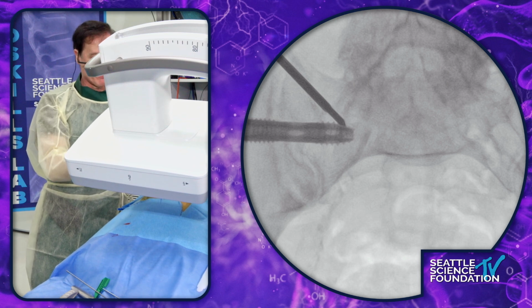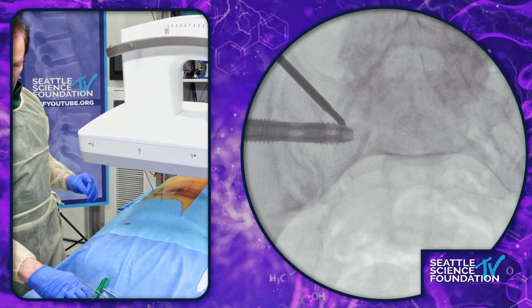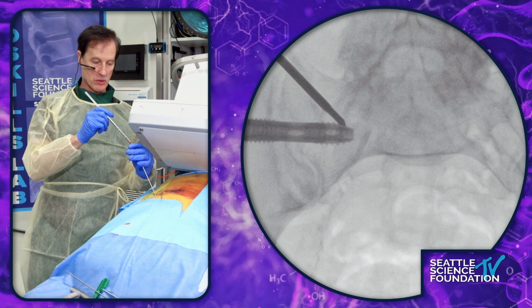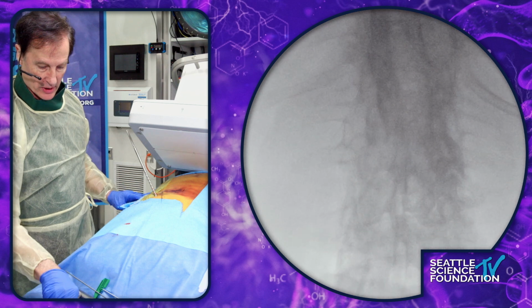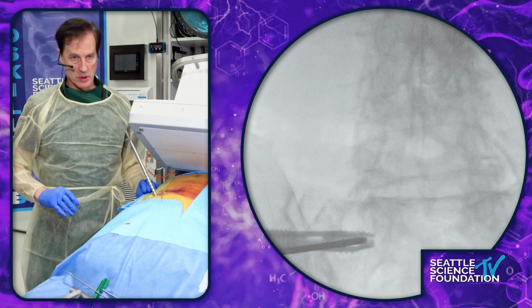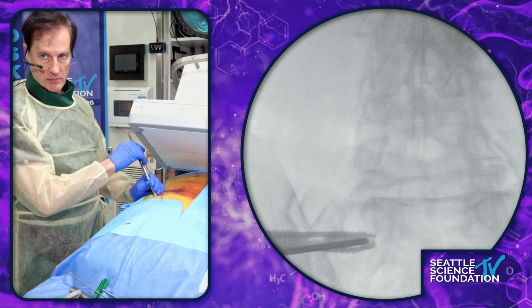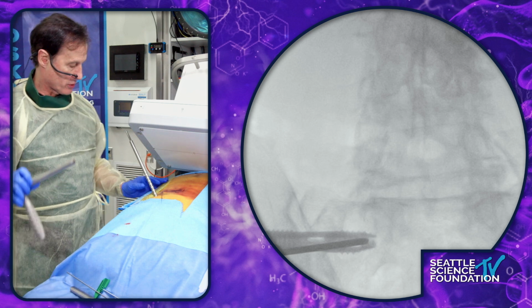Let's go back to the outlet, please. So we'll take the Jamshidi, windshield wiper that thing out, pin and pull, don't lose access. We have dilator 1 down to bone, and the bone here is a lot closer to the skin surface than it is on the lateral view because you don't have any gluteal muscles you're going through. Dilator 2, right? And see, we can see the orientation here. This is the S1 posterolateral screw. And then dilator 2, then working channel.